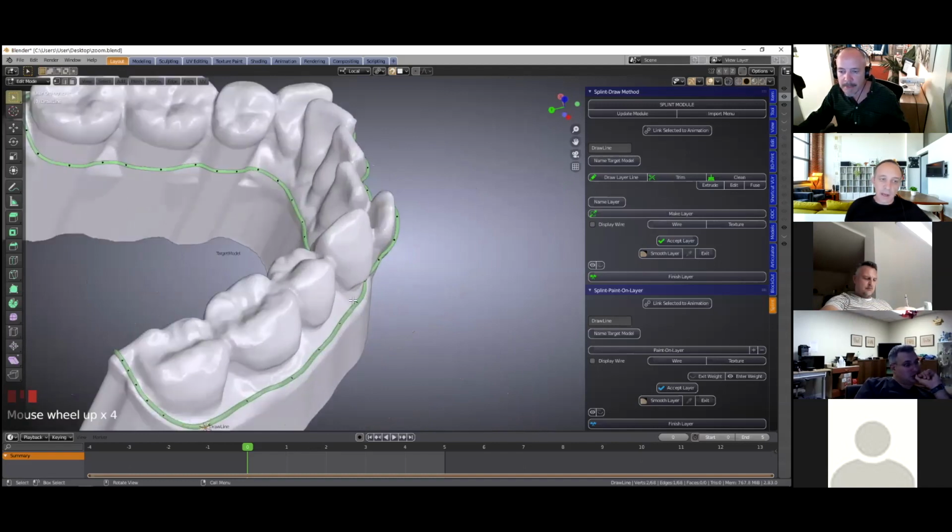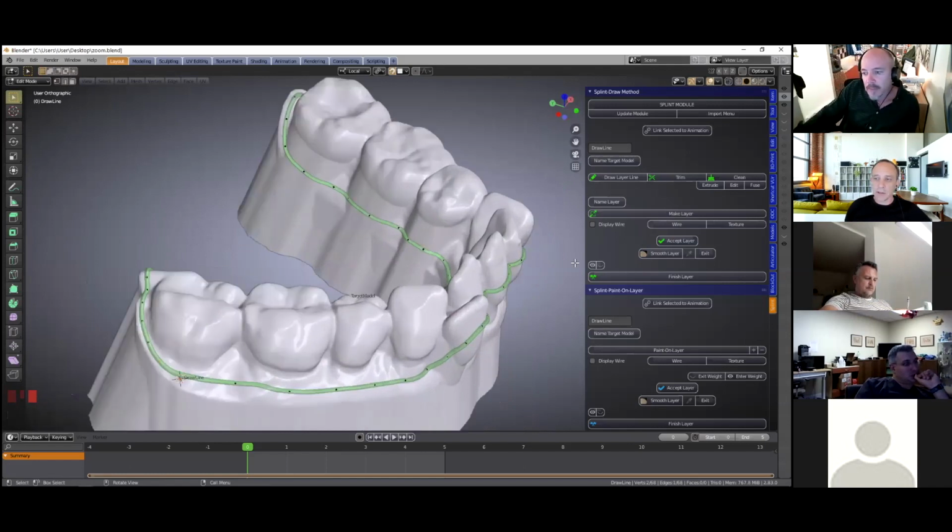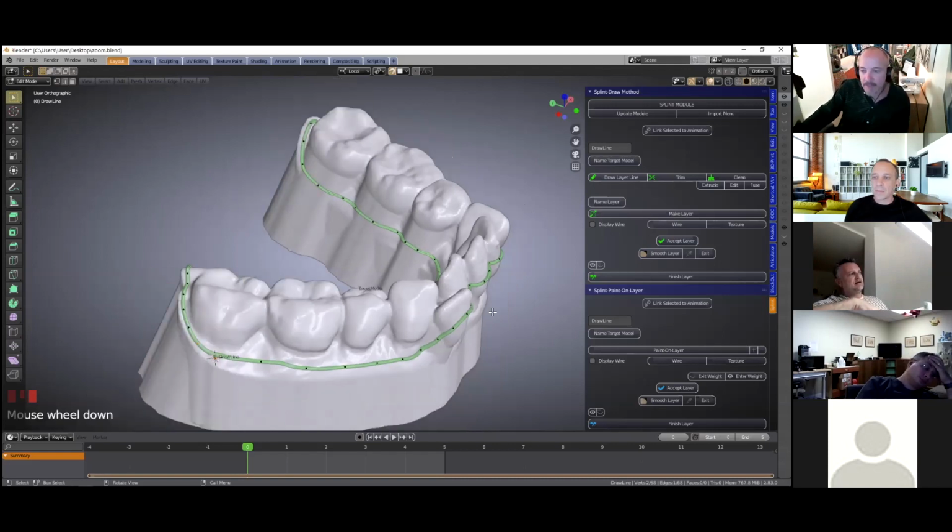Other people use Splint Soft. Have you heard of that? Splint Soft? No. So far, I started to print the models with Blender recently. Before, I was using the printer for plastic before the casting in non-precious alloys. I was designing in InLab, so if I had some bigger non-precious work, I was using the printer just for that.